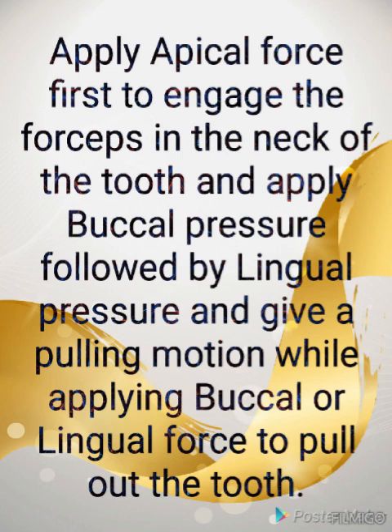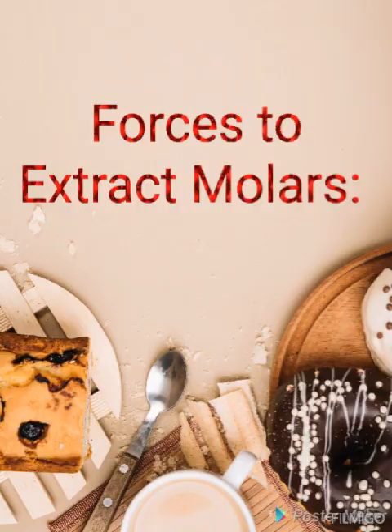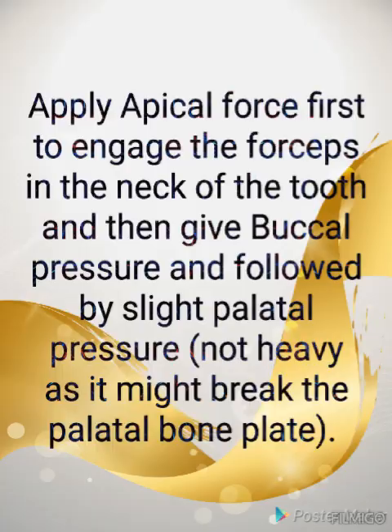There is no rotation. It's very, very important. The most difficult tooth for extraction is the first premolar because the roots are very slender and there are two roots. Next we are going to see movements for molars.